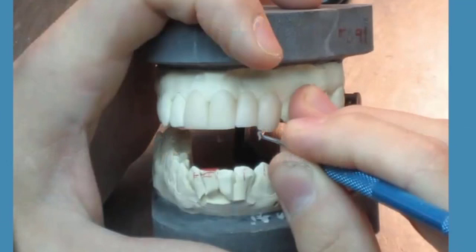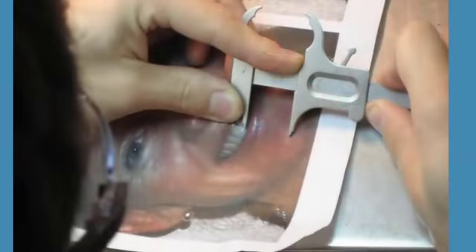Here's a technician doing a diagnostic wax up. Now, they could be looking at a computer screen as well and trying to design the teeth. We have a very limited view of what's here. There may be some writing, make them look ideal, golden proportions, things like that. But that's limited in my book.